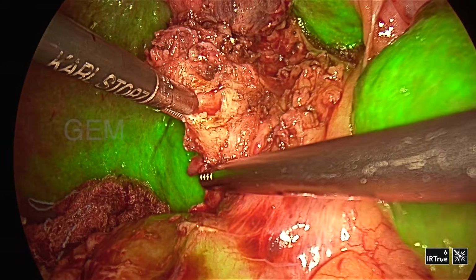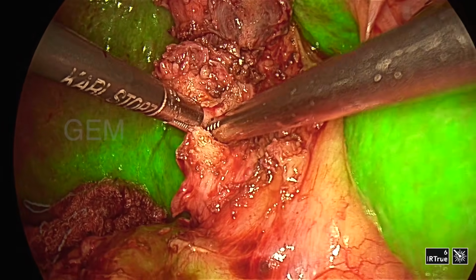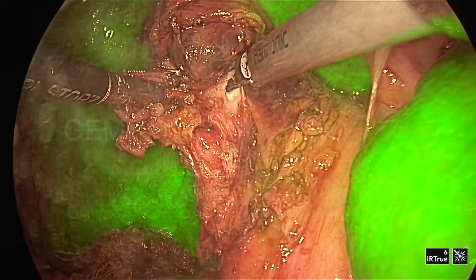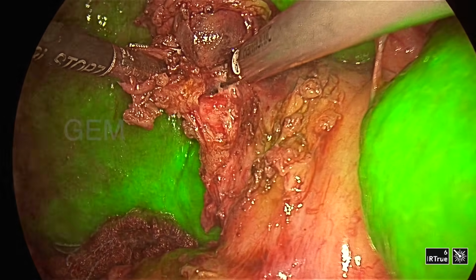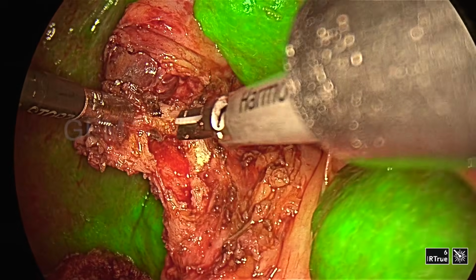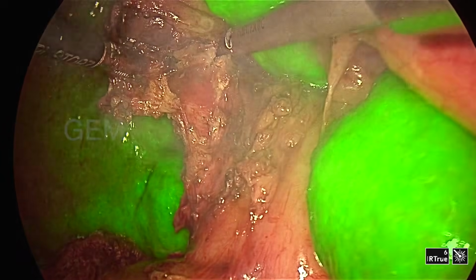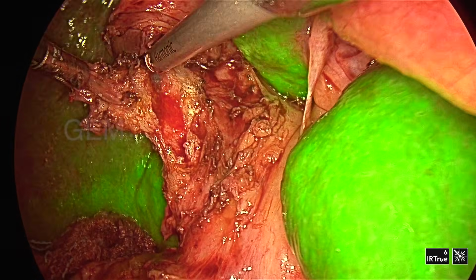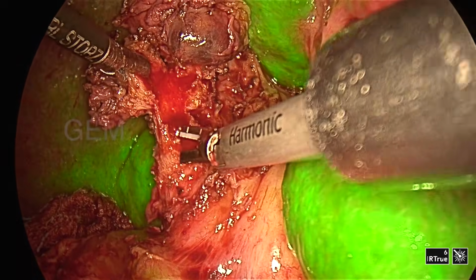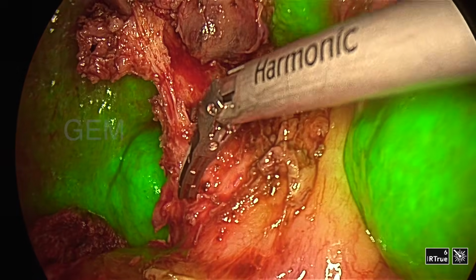See, that mucus kind of secretion is coming. It is not bile. So I find the opening. I don't want to take the posterior wall of the cystic duct, as that will be adherent to the right hepatic duct. So I cannot remove the posterior wall of the cystic duct here, otherwise I will injure the right hepatic duct. So such a difficult case, difficult situation. You can see I open the cystic duct. So again I am seeing the CBD.